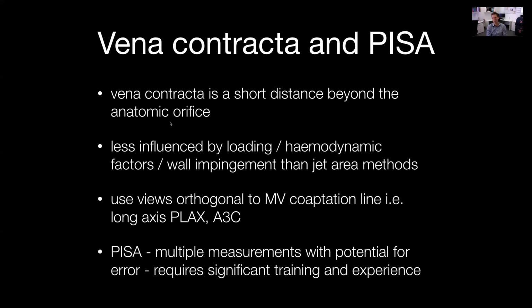Greater than 6-7 millimeters is severe. It's less influenced by loading and hemodynamic factors than the other ones, so it is worth doing if you're not sure.